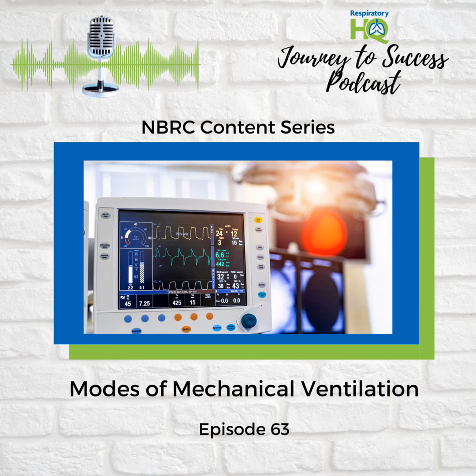Okay, I think I'm getting this. Trigger starts the breath, limit keeps things safe, and cycle tells the machine when to switch to exhale. You got it. Now, where things get really interesting is how these variables are manipulated in different ventilator modes. Let's dive into those modes.